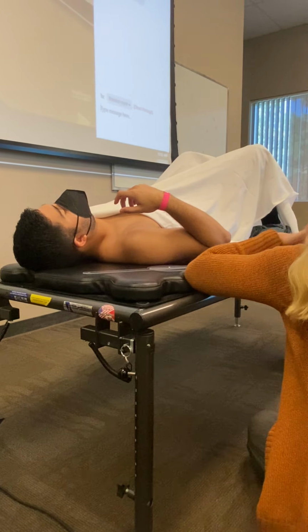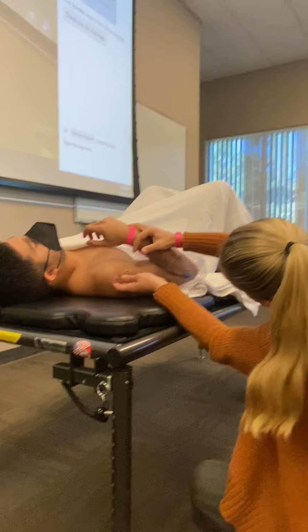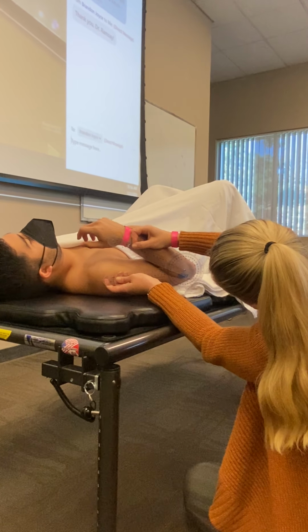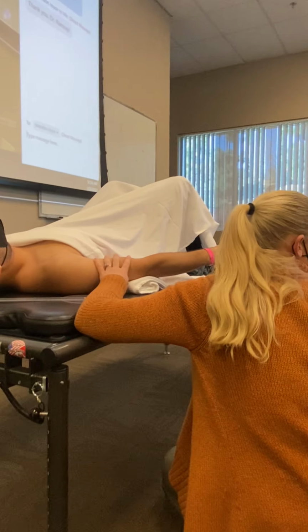Again, same landmarks, same process. I'm going to take him to end range. I feel a soft end feel. That looks like it's about 160 degrees to me. I'm going to bring him back, get him relaxed, take it to 160. Doing okay there? Any pain? Palpating for those bony landmarks. And I was off. It's actually 152. So I'd say his range is 0 to 152 degrees of elbow flexion.